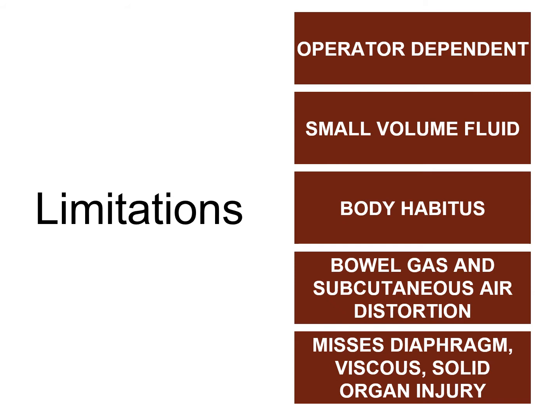And then the most important thing, especially when we're talking about trauma patients, is that it does not help you detect diaphragmatic injuries, hollow viscus injuries, and solid organ injuries. And that's important because we do it mostly on trauma patients. Those are potential traumatic injuries. Many of them require surgical repair, and the FAST exam won't help you detect the presence of those injuries. If those injuries have led to free fluid, sure. But otherwise, those things are going to require CAT scan. So that's where the CT for the hemodynamically stable patient with a negative FAST is still an important part of the workup.